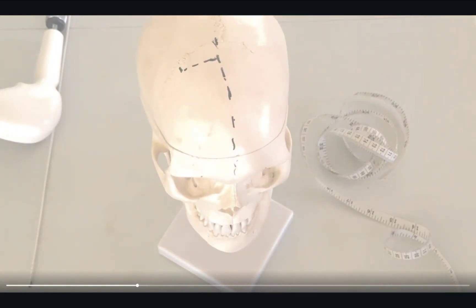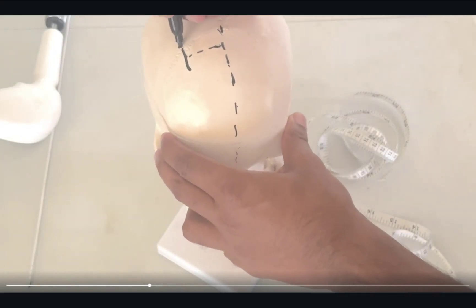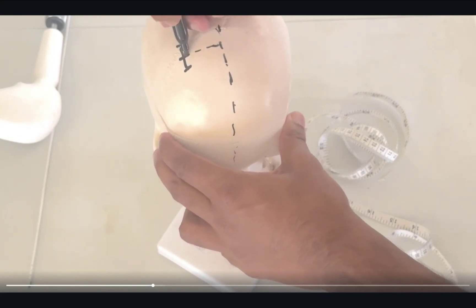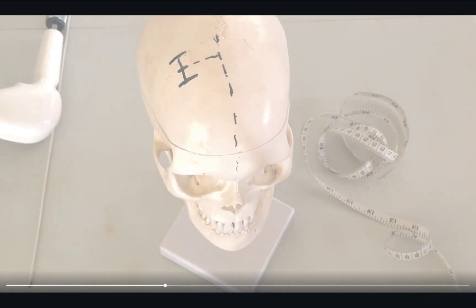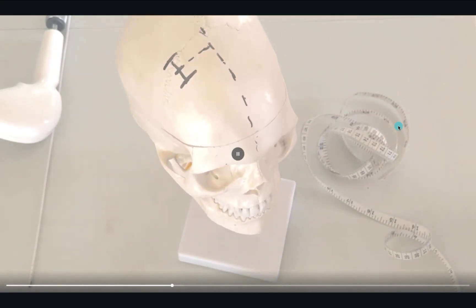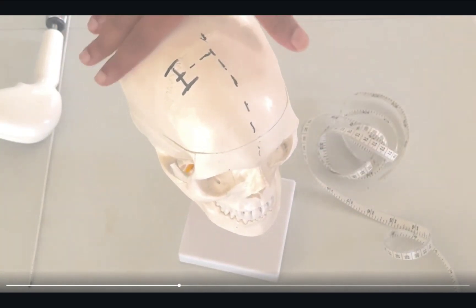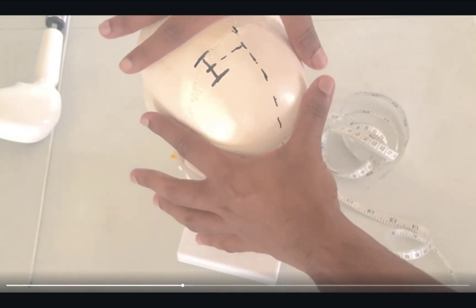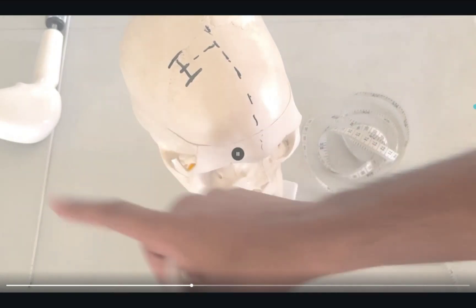Once you've got your incisions marked out, then you would want to draw a small incision line. You've clearly identified your landmarks. When you're prepping with your drapes for the procedure, you want to prep the midline and make sure you have a large angle so that once you've actually put the EVD in, you have space to tunnel the EVD out.